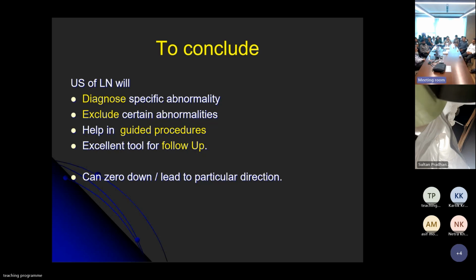But in general, would you agree that retropharyngeal nodes are uncommon? That's why ultrasound somehow sails through. We tend to get recurrences or residuals only in these areas because in a routine neck dissection, we will not go and dissect this. And in nodal biopsy, for radiologists' understanding, we generally should take the first sample into saline, so we would always retain that for tuberculosis if required. Sometimes we overdo that, but it helps in certain cases. Then the next subsequent sample we take in formalin.